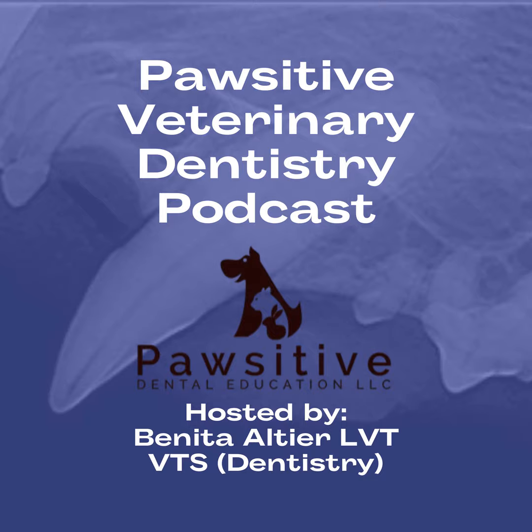So stage 3 is where it invades into the pulp. This is where clinically you're going to start to see that little fleshy response, a little bit of soft tissue, because the pulp is exposed and you get a little bit more of an inflammatory reaction. But in stage 3, the majority of the tooth structure, both the crown and the root, are still present.